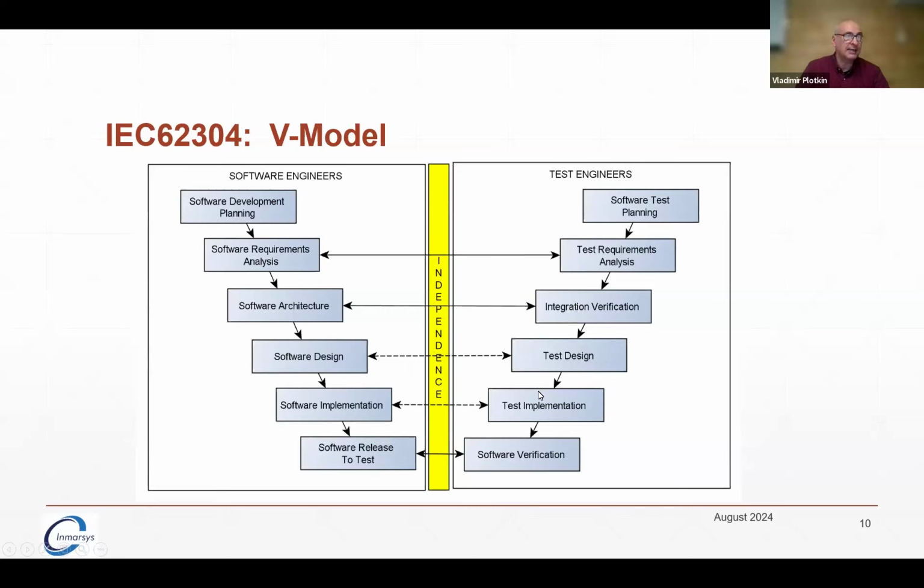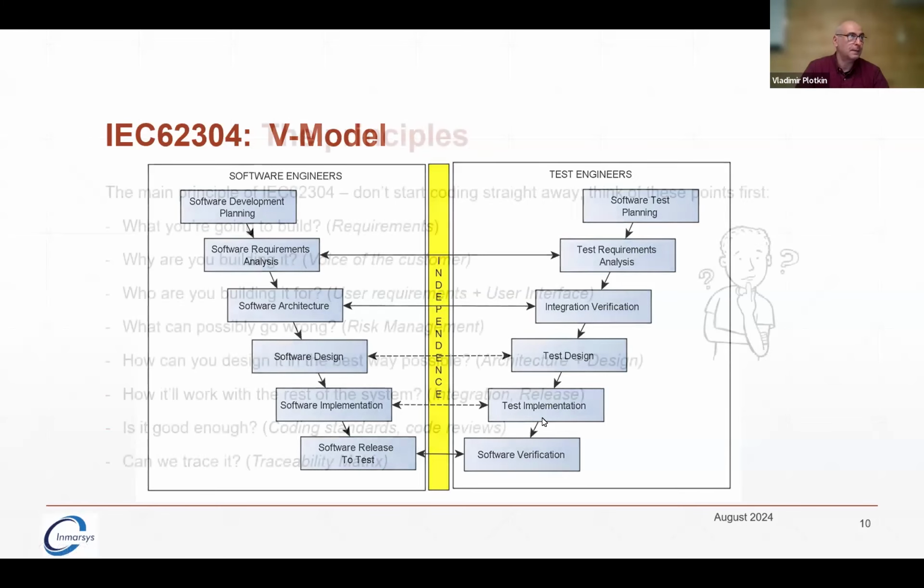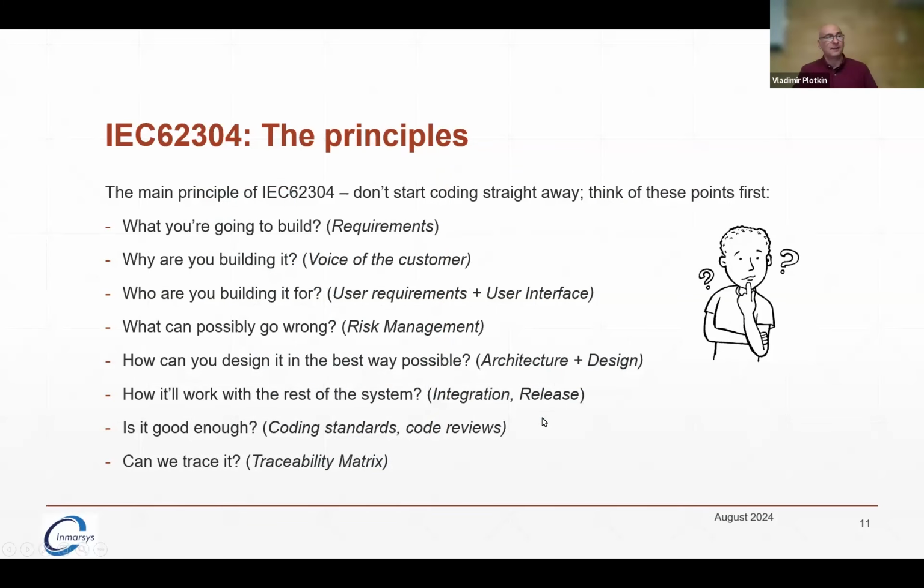They will design the test cases, they will implement them, and then once they get the formal release, they will start doing the software verification activities. That's in a nutshell the V.